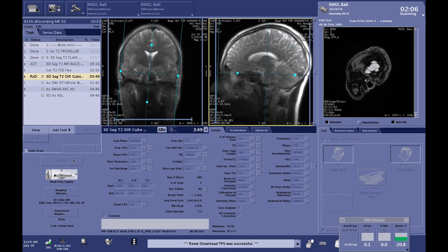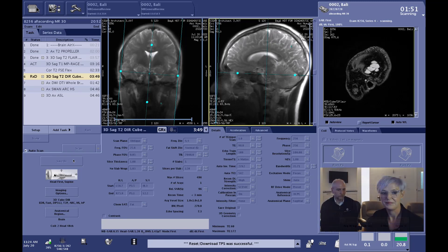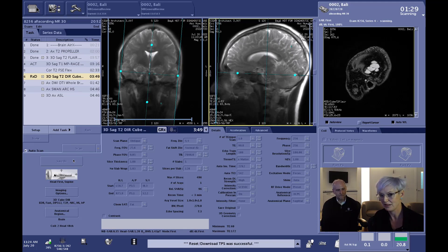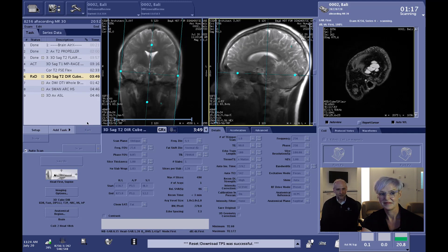Without Air Recon DL you're typically scanning at 1.3 or 1.4 isotropic, so that's probably a 50% or more improvement in resolution alone, and scan times were also much longer — four and a half minutes plus, in addition to the lower resolution. This is a really nice demonstration of how Air Recon DL improves SNR and overall quality. The significance is especially beneficial for brain diagnostics because everything is suppressed, making it easier to detect pathology. This is a very valuable pulse sequence for patients with demyelinating diseases such as multiple sclerosis, making it easy to demonstrate white matter hyper-intensities.